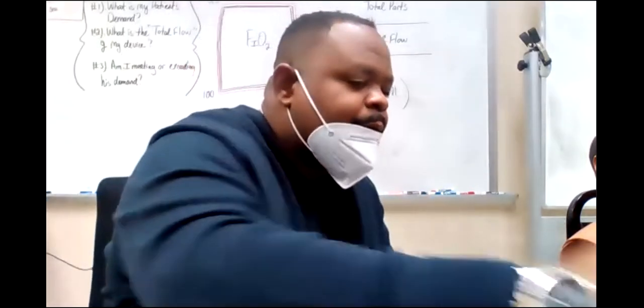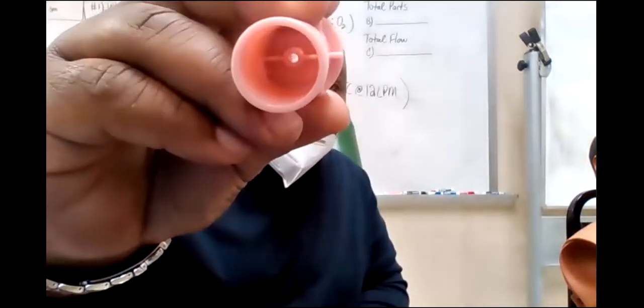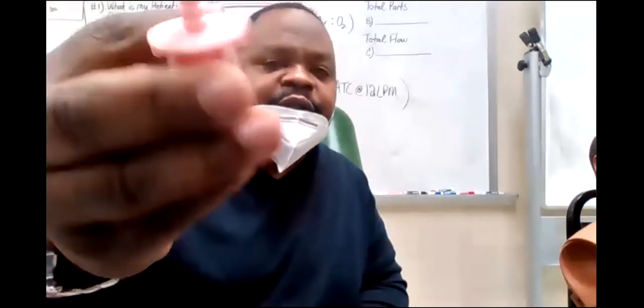Okay, let's look at the pink one. The pink one, if you notice, is larger, right? Has a larger orifice. See how big that is? So let's see what the percentage is.